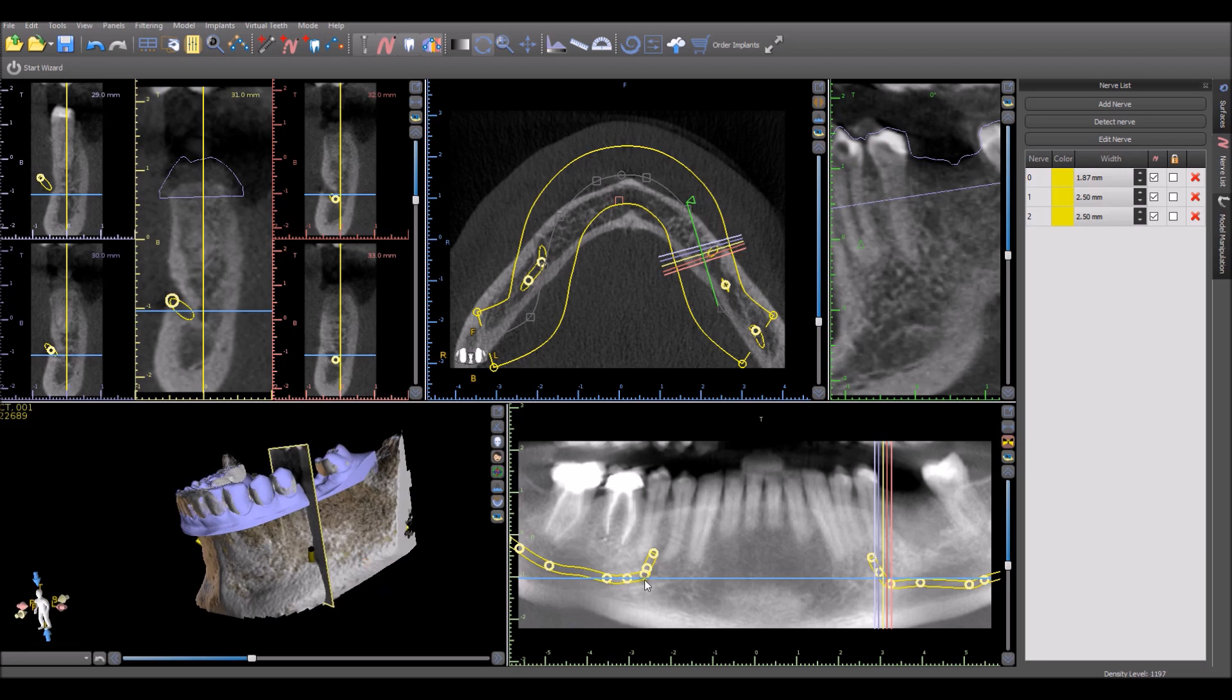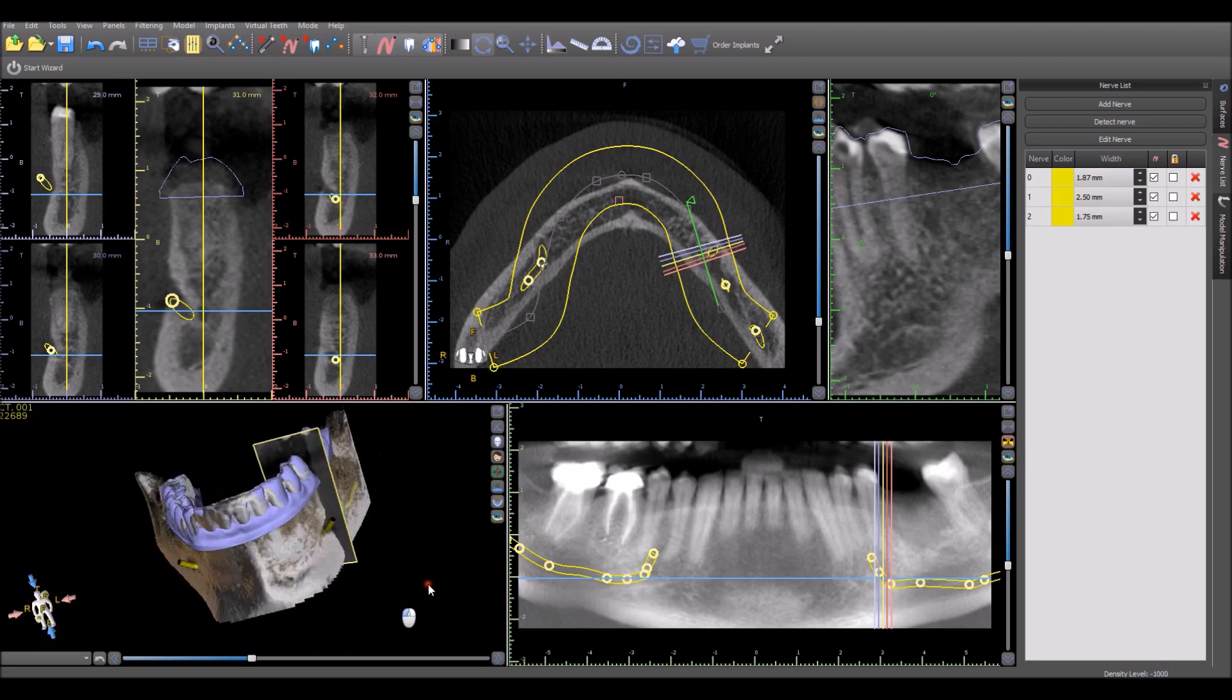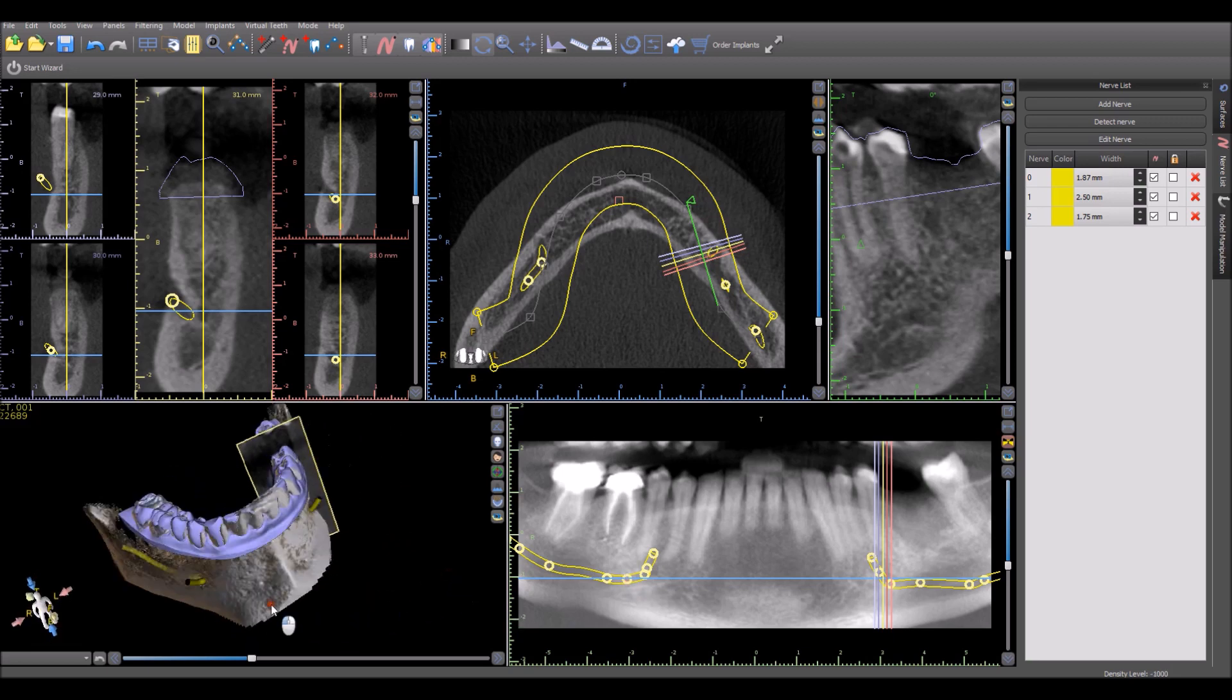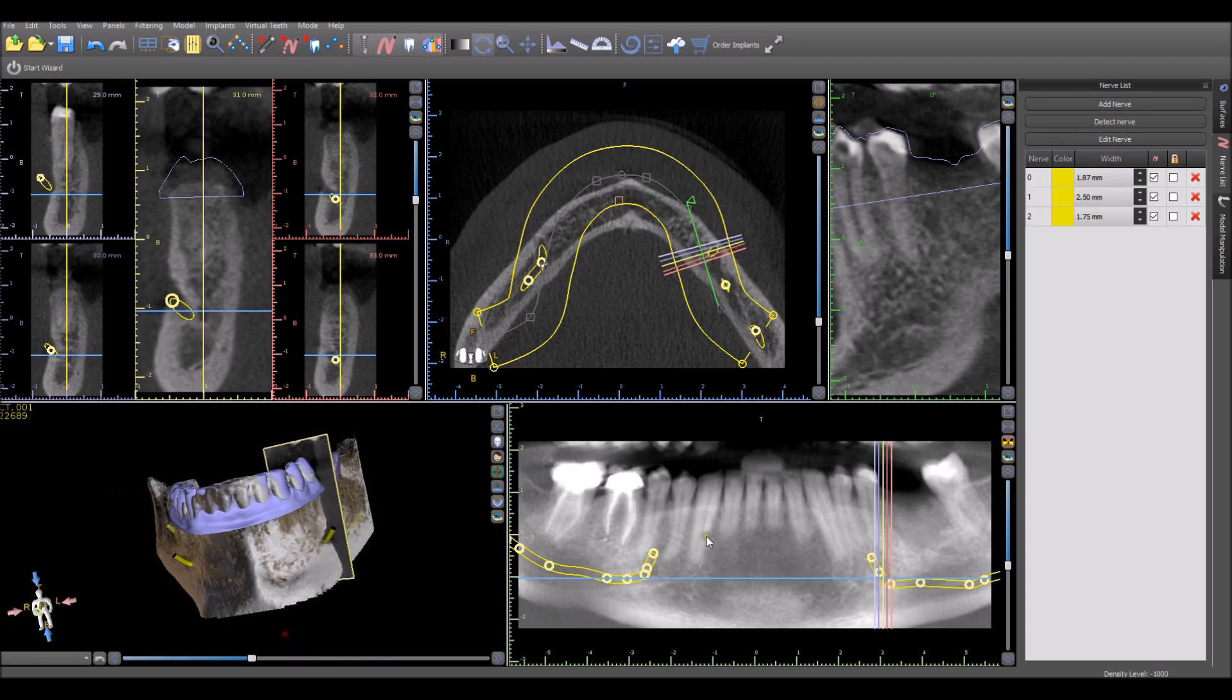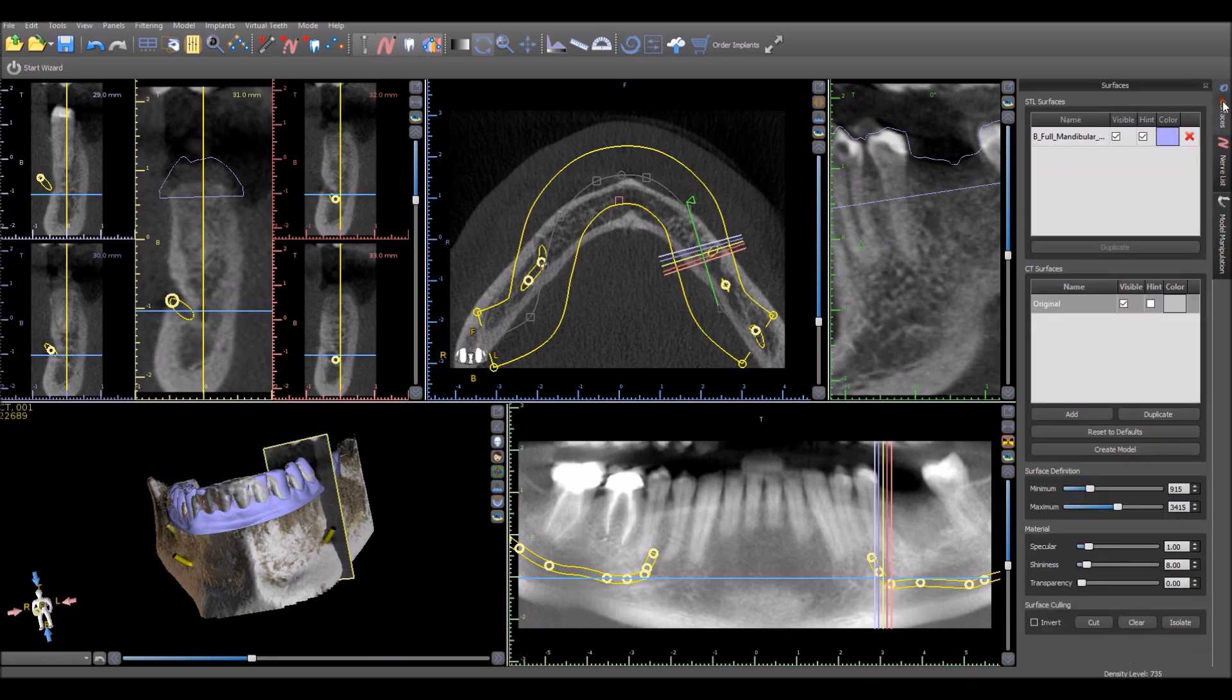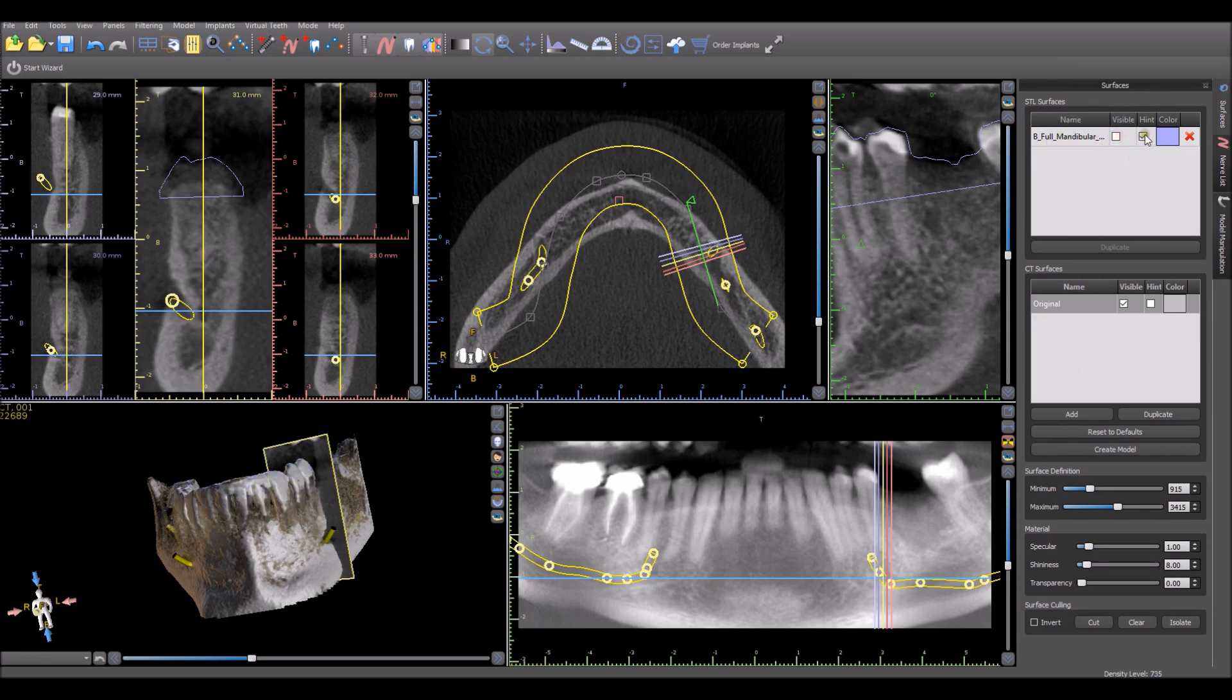If we want to modify any of the placements, we could grab the nodes in any of the views, grab and drag and fine-tune the positioning. So we had our panoramic curve was drawn automatically, our nerves are drawn automatically. Now we want to go ahead with treatment planning. For this, we could turn off the model. We could see in the Surfaces panel that now we have the additional surface of the model. We could hide this for the treatment planning purposes.